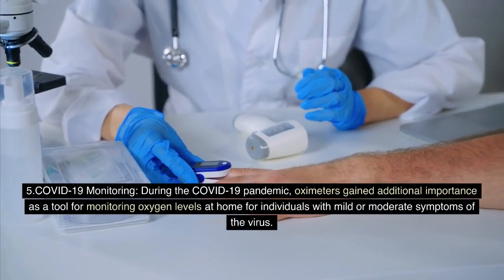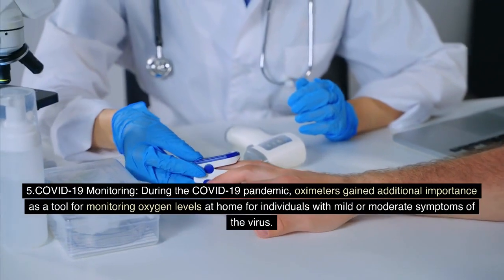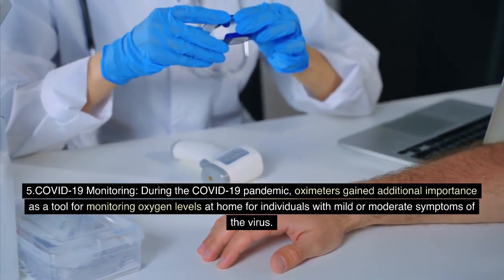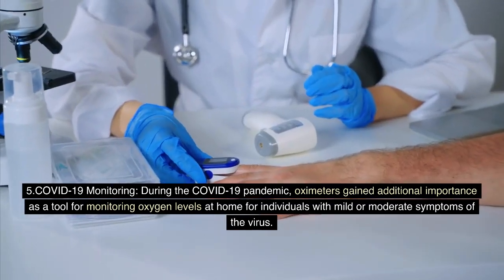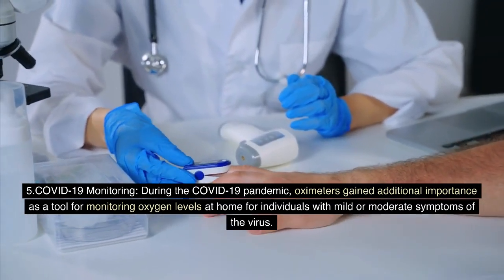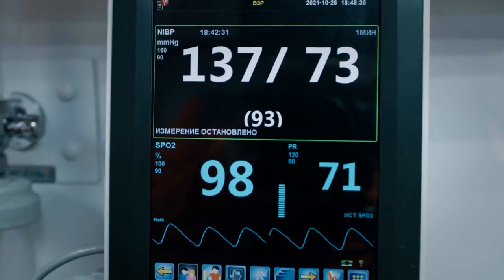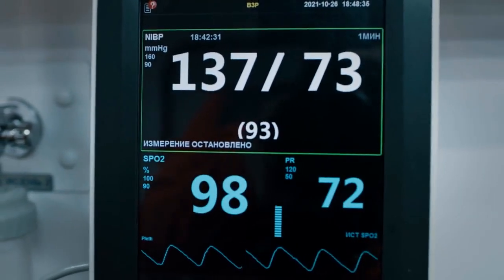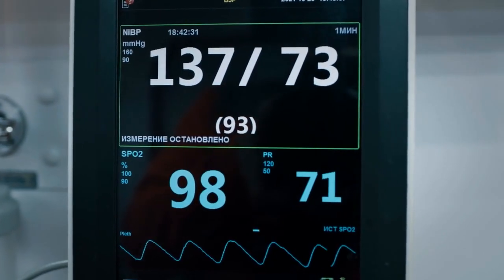5. COVID-19 monitoring. During the COVID-19 pandemic, oximeters gained additional importance as a tool for monitoring oxygen levels at home for individuals with mild or moderate symptoms of the virus. Low oxygen levels can be an early indicator of respiratory distress, prompting individuals to seek medical attention if needed.